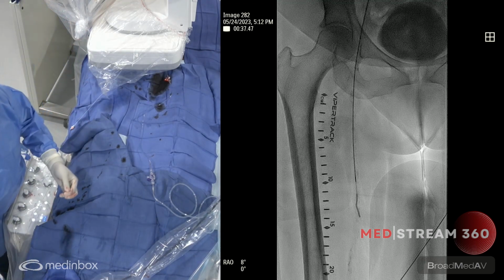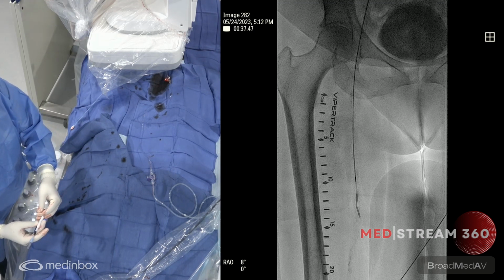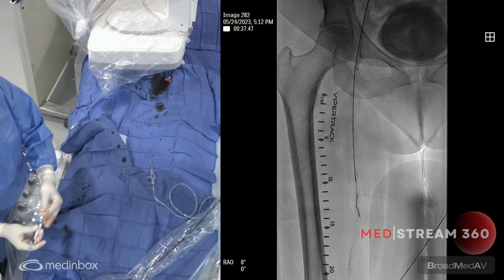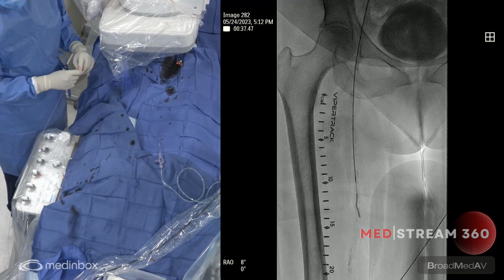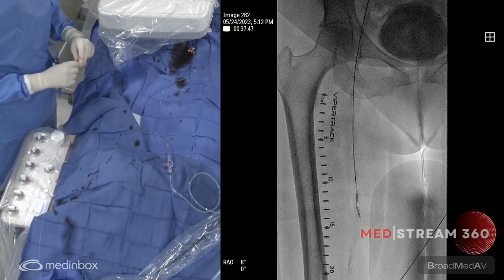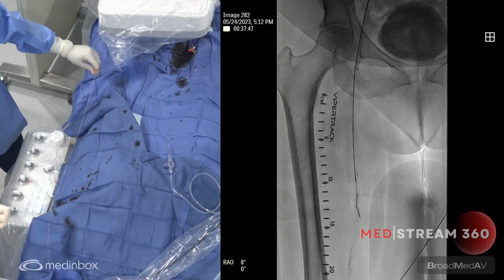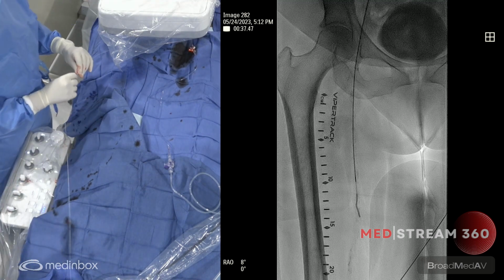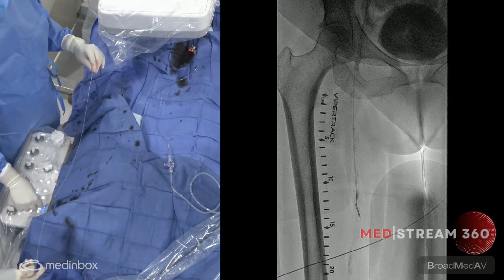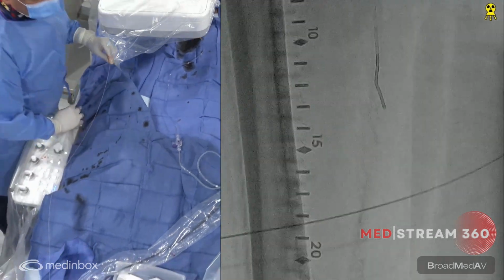So in the back we have a little torque device as well as a little spinner, which I'll be spinning here, which will allow me to spin the catheter through. And for support, we're going to load what's called a stiff wire. In this case, we're going to use an Asahi Confianza Pro. Not that we're going to use that to actually cross the lesion, but to give support to the catheter as we cross the lesion.